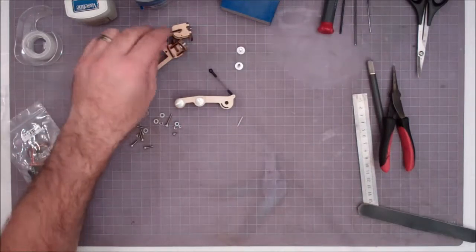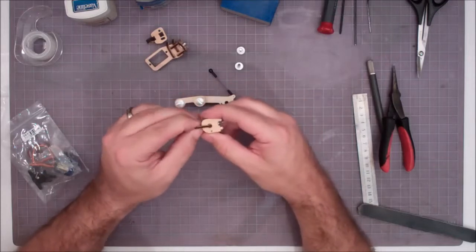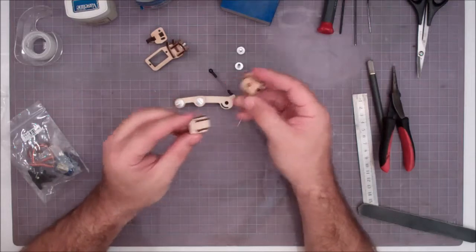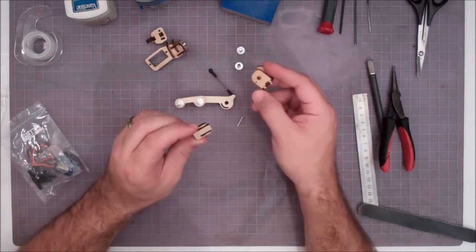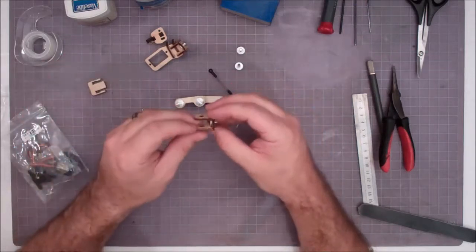The next part here is to go ahead and take our base plate that's been drying over on the side, and we'll go ahead and remove our fixture jig. Now you'll have received 2 of these with a hand kit, so if one of them breaks, you're okay, you've got a second, but these are reusable, so go ahead and save them.